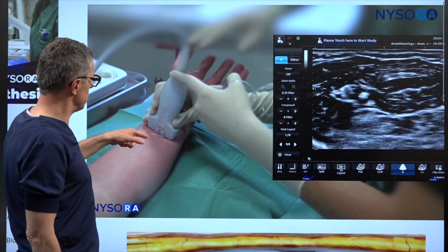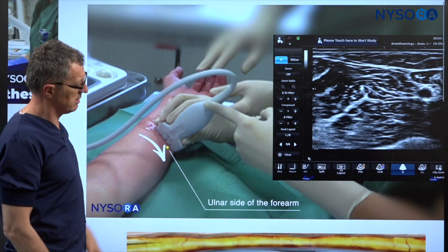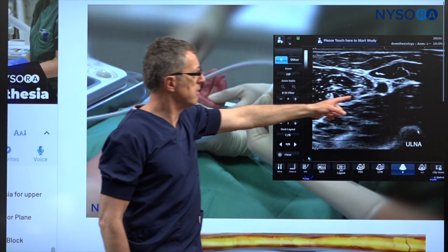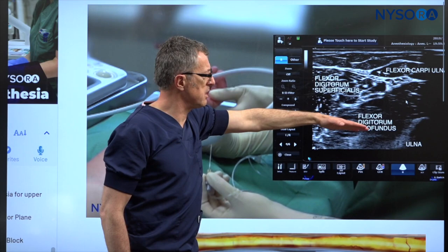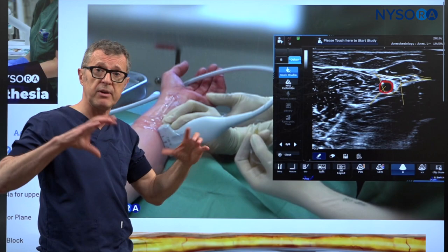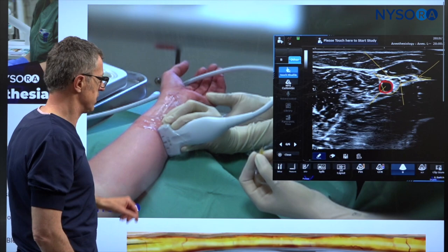Once we accomplish the median nerve block, all we want to do is scan more medially. The transducer is simply slid more medially on the medial side of the forearm. Here we immediately see the ulnar artery and the ulnar nerve. These are the tissue sheets we're interested in — the superficial flexors and deep flexors make fascia sheets where the ulnar artery and ulnar nerve reside. That's where we aim to inject the local anesthetic. It's not a perineural injection, but an injection into the sheet that contains the nerve.